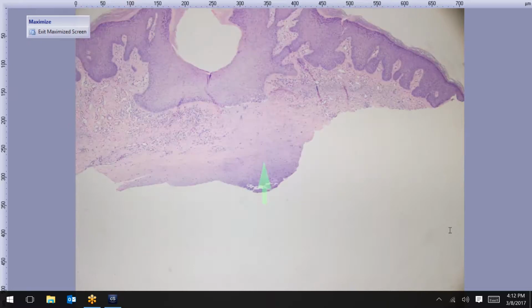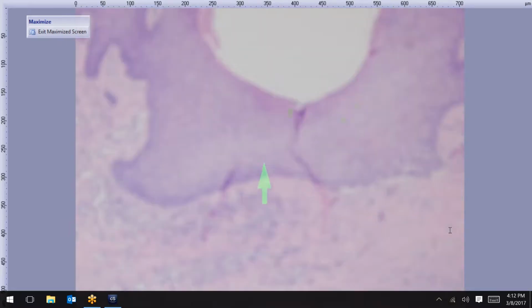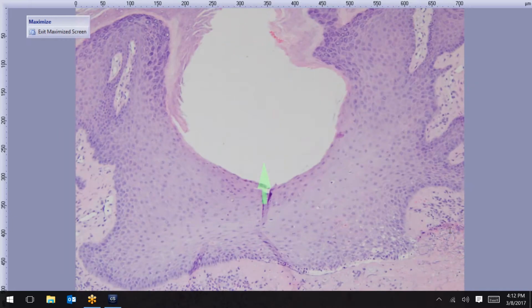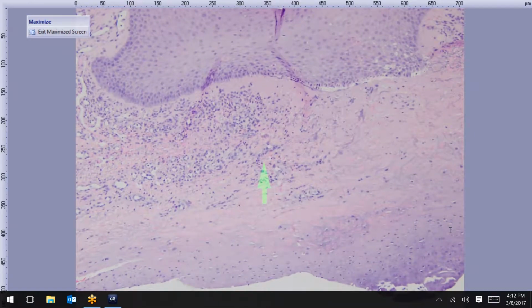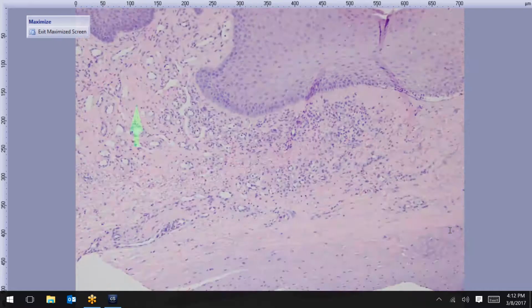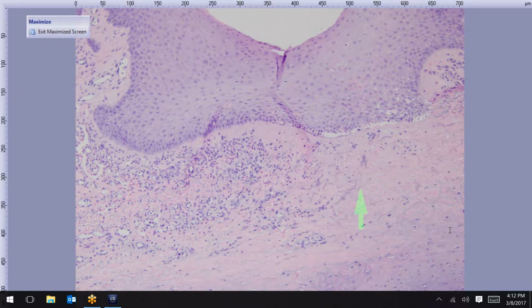All right, this is just kind of an epidermal invagination here with a little hyperplasia. And I think somebody's already put in a comment, and that's correct, because you see that this is sort of degenerated collagen underneath here. You've got a little vascular proliferation, and you get a little fragment of cartilage. It was a nice clue. So this is, just as you said, a chondrodermatitis nodularis helicis.